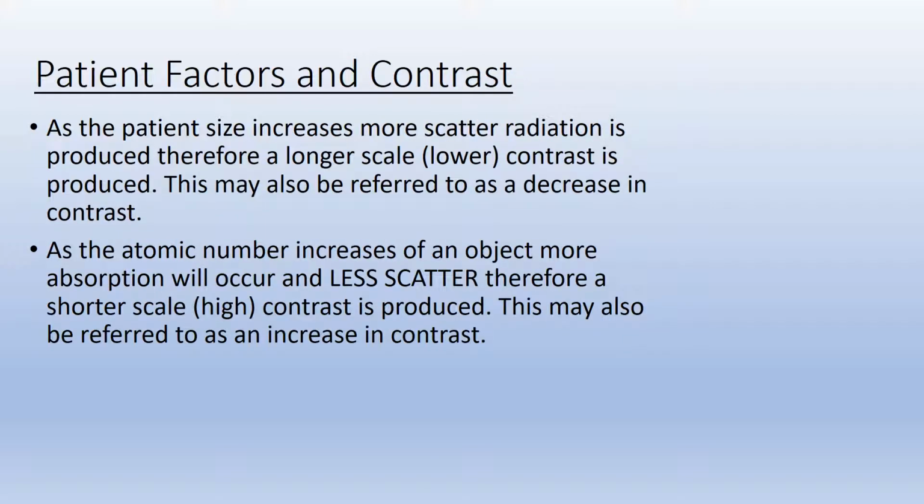Now let's talk about those same factors and the impact on contrast. As the patient size increases, more scattered radiation is produced. Therefore, a longer scale or lower contrast is produced. This may also be referred to as a decrease in contrast.